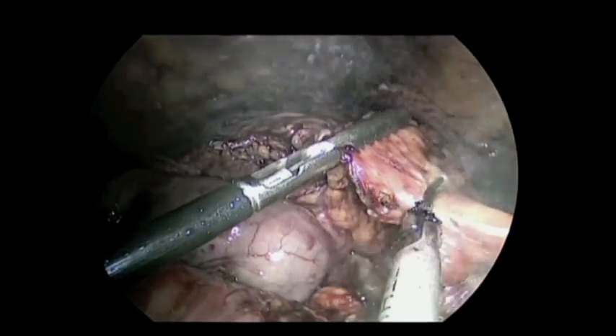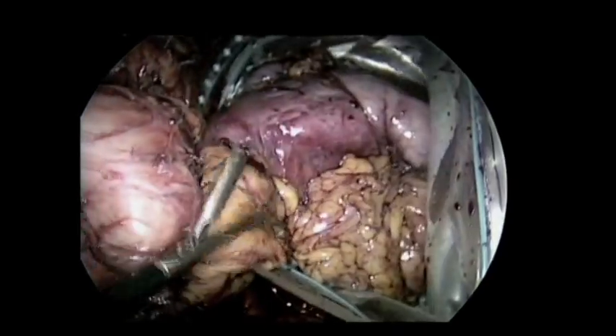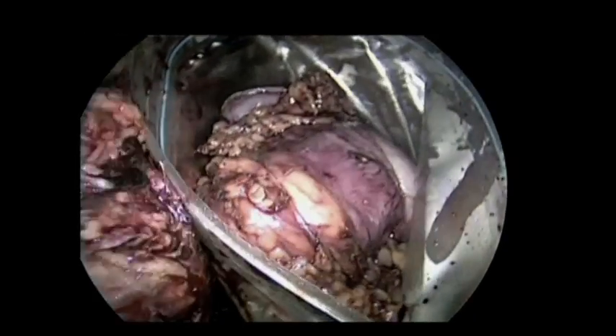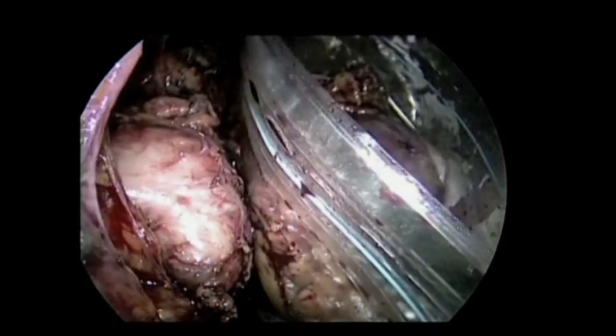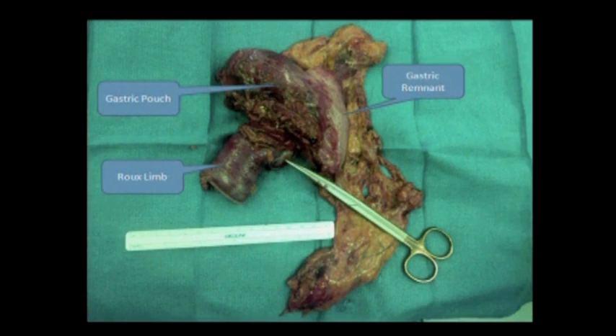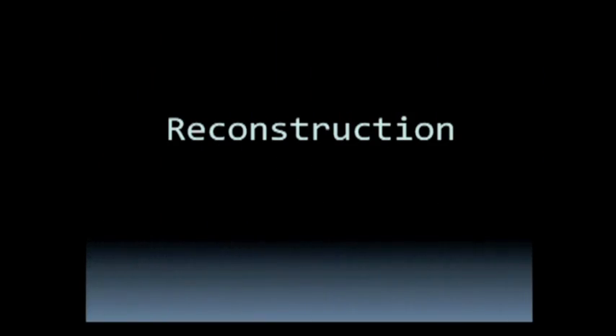We tried to keep the lymphatic tissue as much as possible with the specimen. The specimen was retrieved through an Endocatch bag through the abdominal wall using a wound protector. The specimen consists of the proximal part of the gastric remnant, gastric pouch, and proximal portion of the Roux limb with gastric mesentery. Here we opened the specimen and showed severe stricture of the gastrojejunostomy — the scope couldn't pass even intraoperatively — and no evidence of a clear mass.